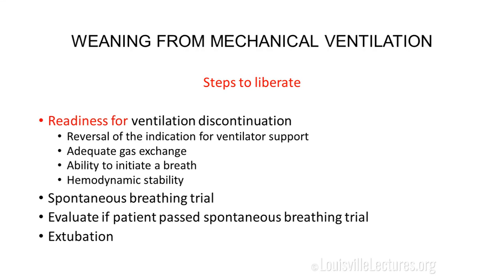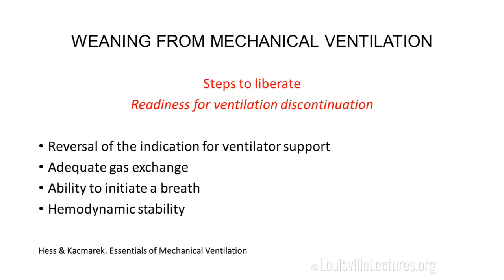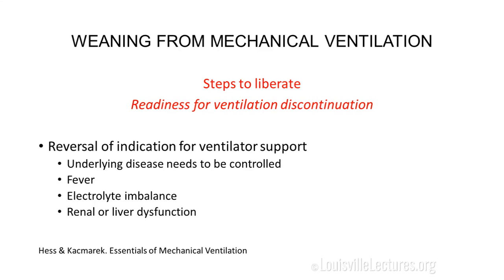So we're going to start off with readiness for ventilation discontinuation. What that entails. So that has 4 steps. Reversal of indication for ventilator support, adequate gas exchange, ability to initiate a breath, and hemodynamic stability. So here, reversal of indication for ventilator support, basically the underlying disease needs to be controlled.